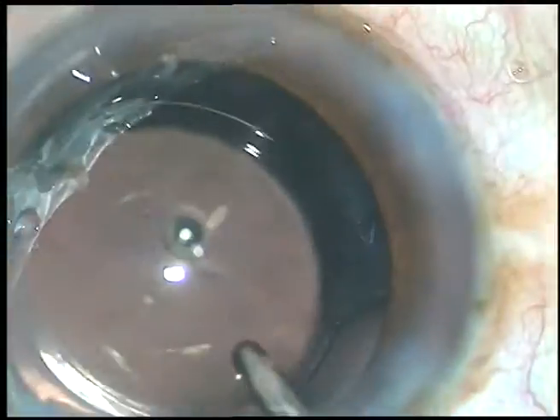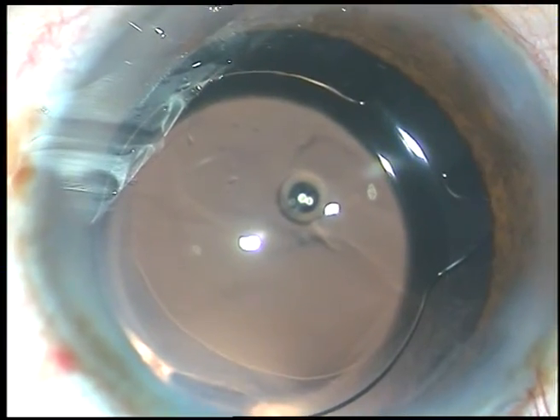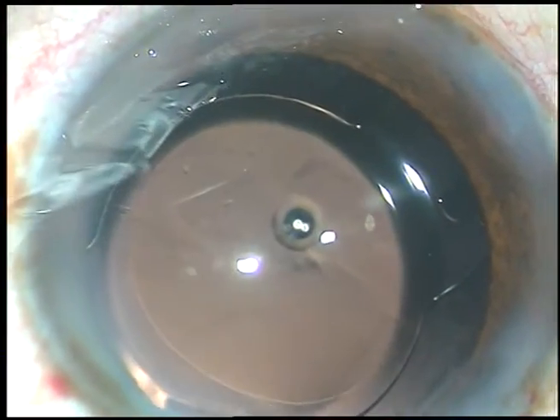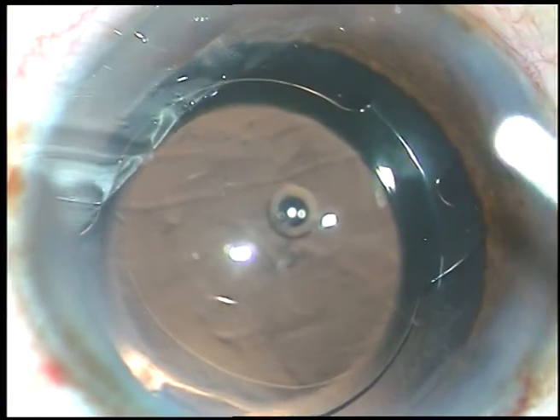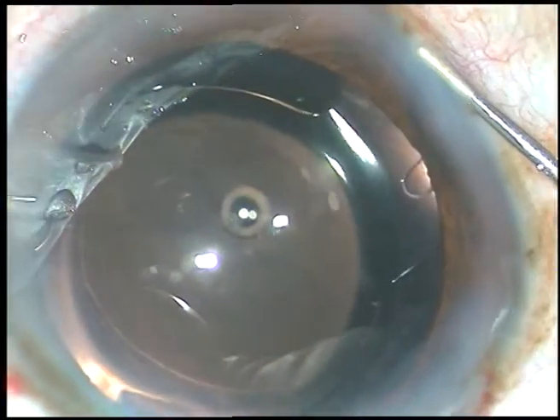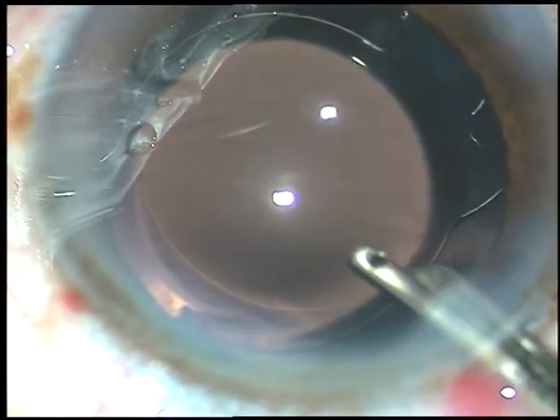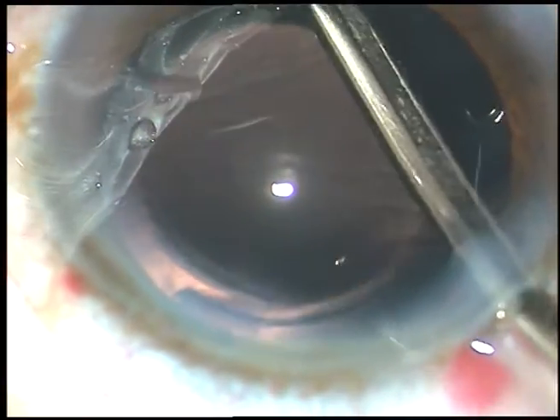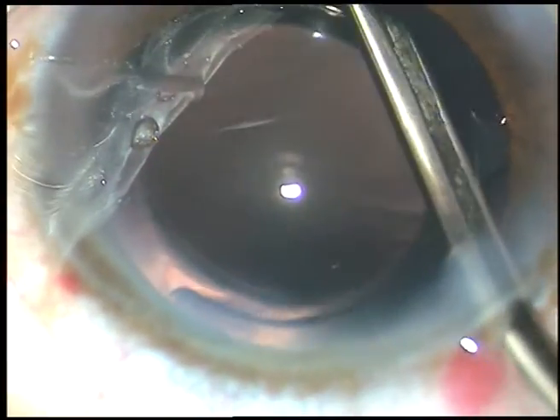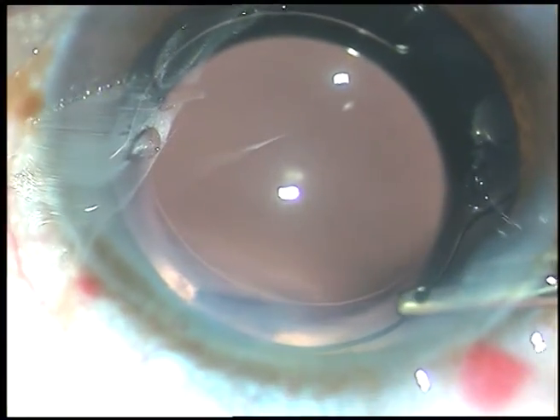The case is done. The side ports are hydrated. This is a bit of moxifloxacin. The stroma on either side of these stab incisions are hydrated to make these wounds self-sealing. The final lavage of the anterior chamber is done, the chamber is formed, and the case is concluded.